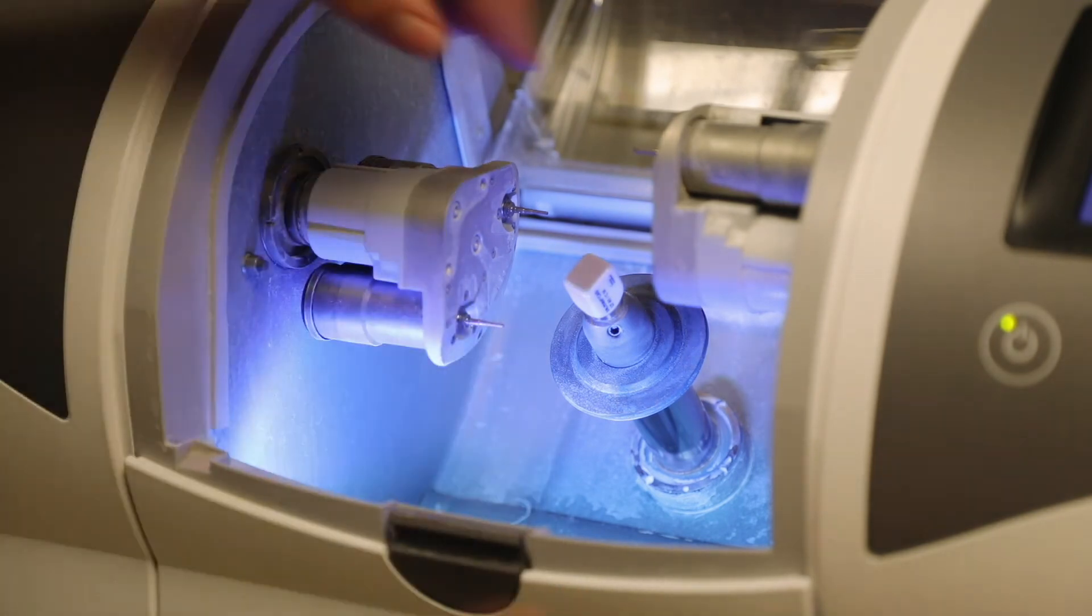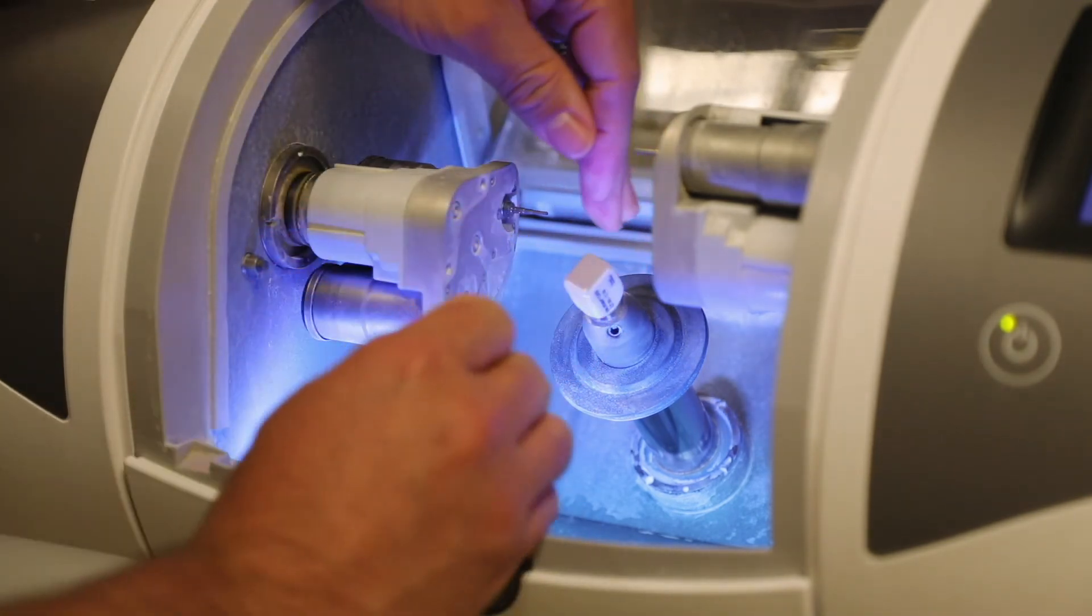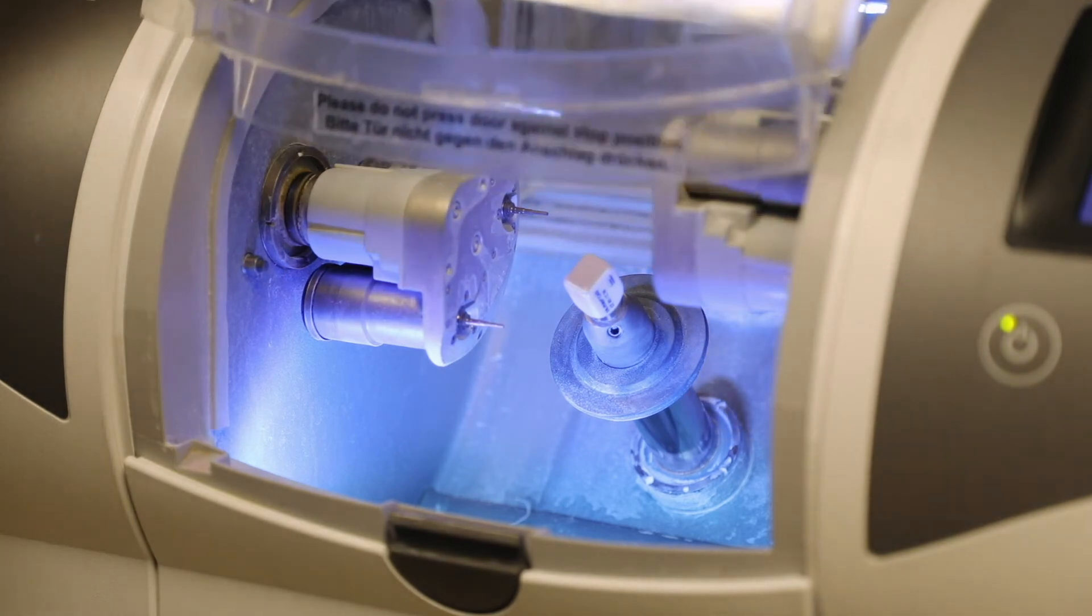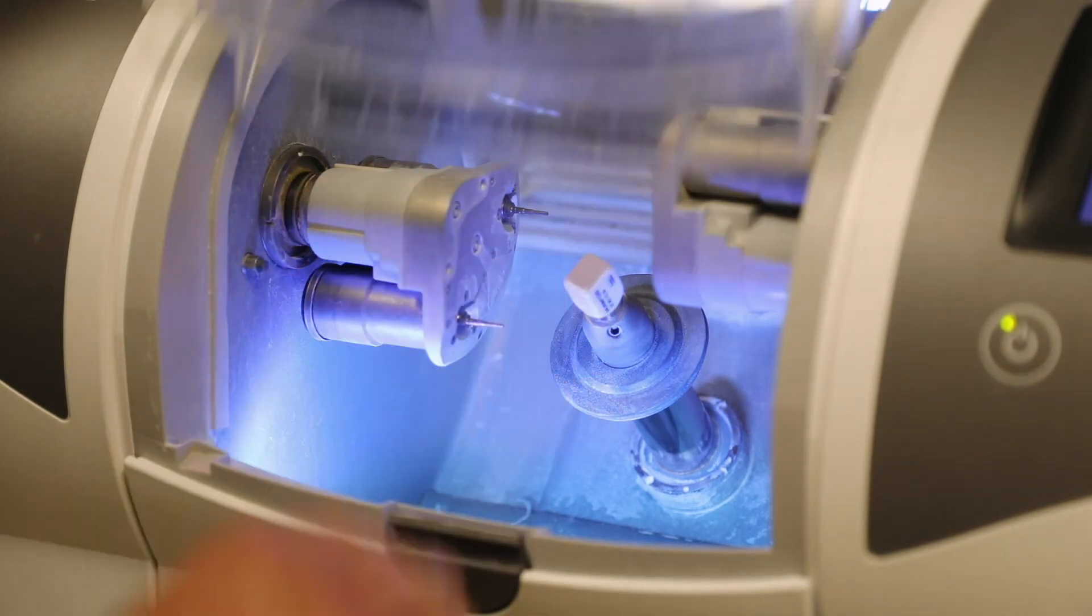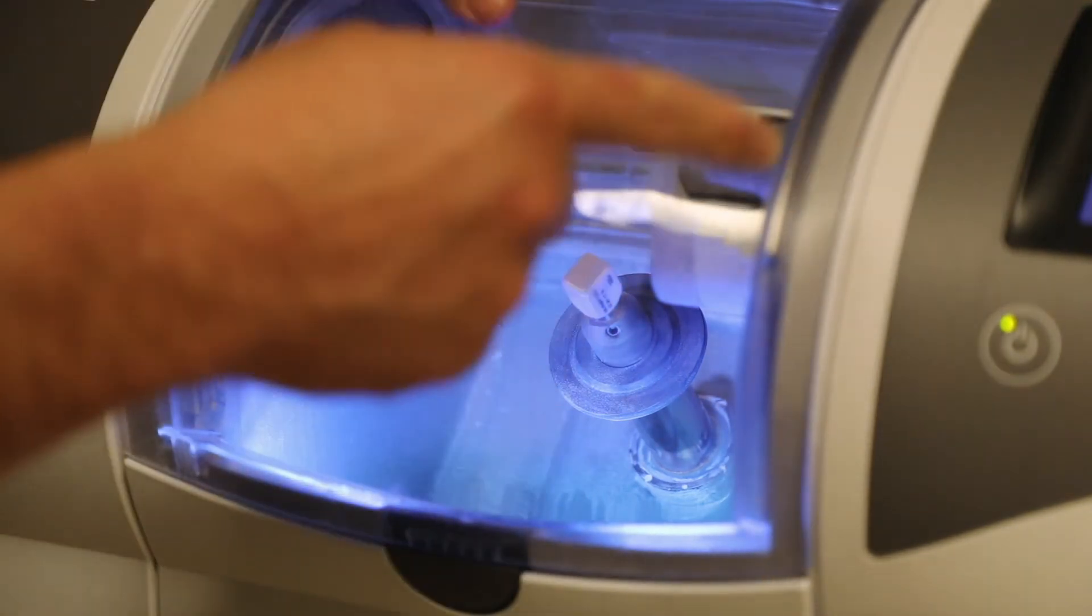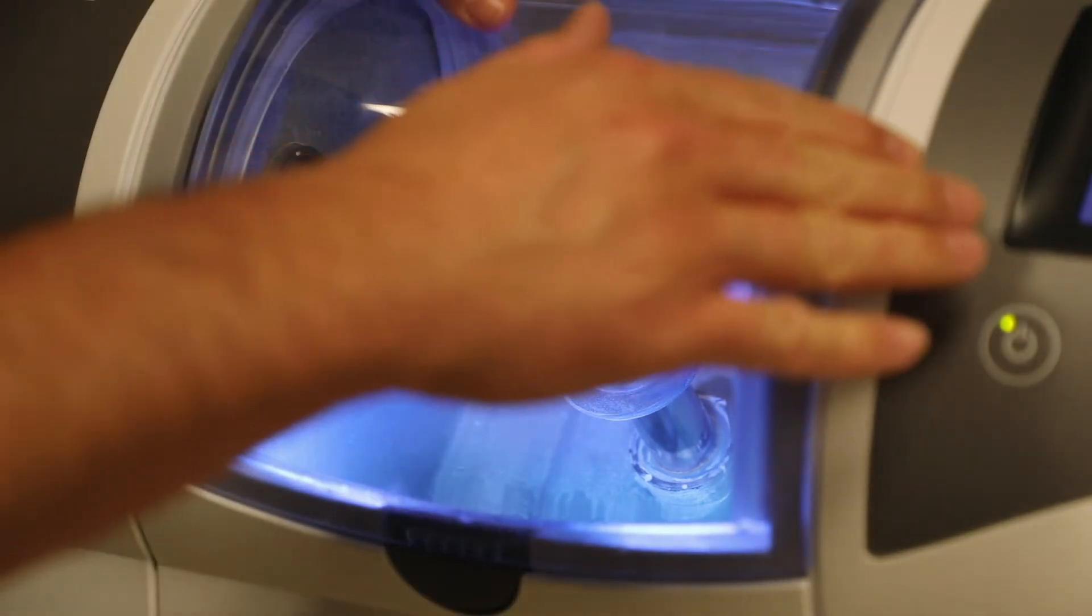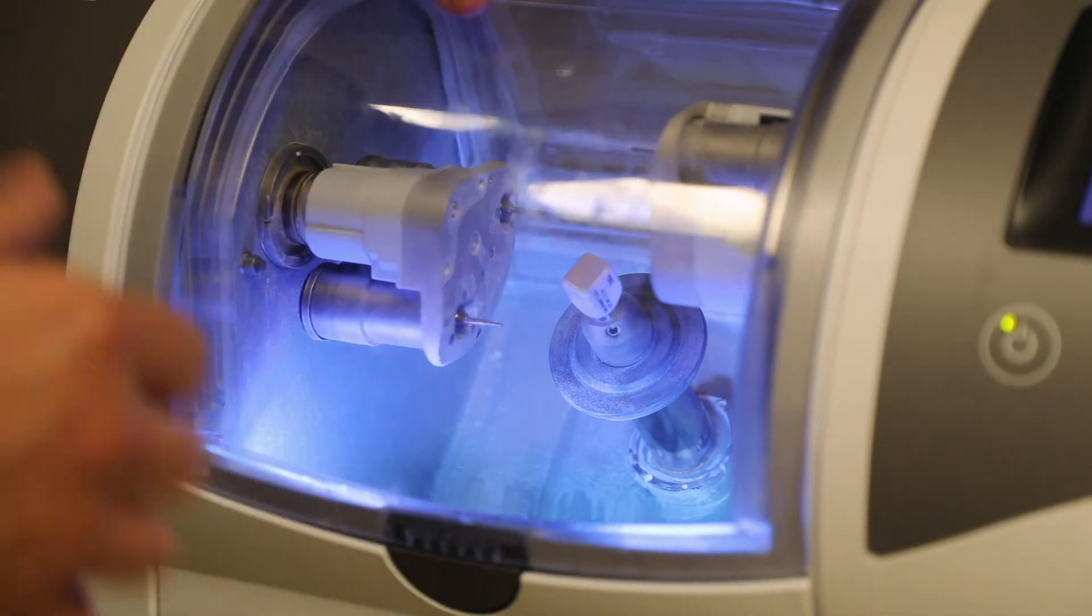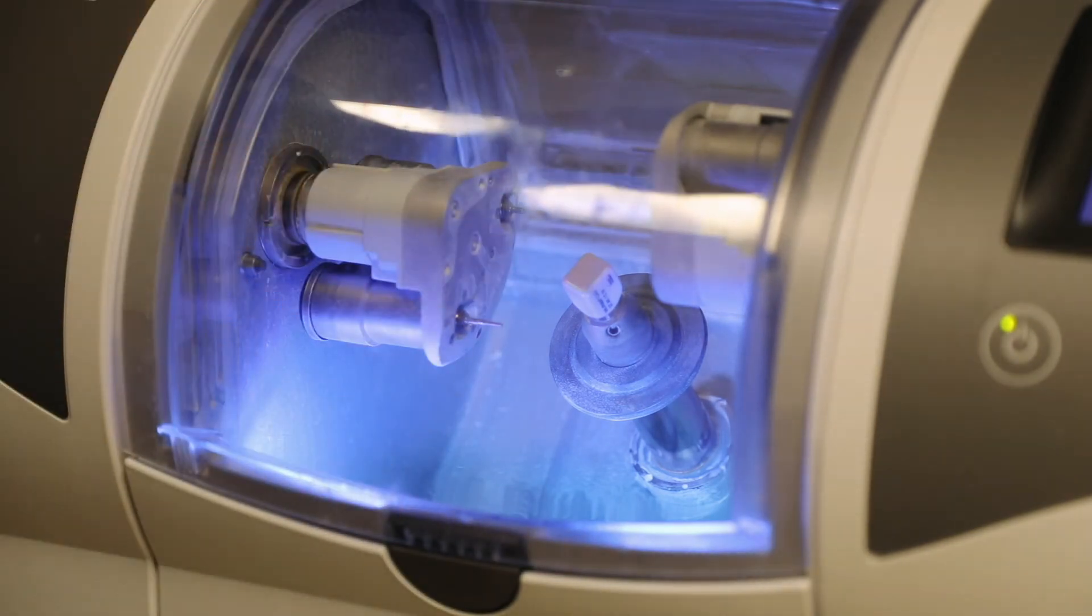All right, now that we are ready, we got the block in, we can shut the lid back down. And then I can either start the milling process here on the milling machine, or I can go back to the actual computer screen and start it there.